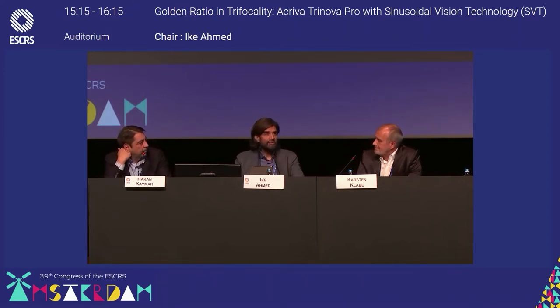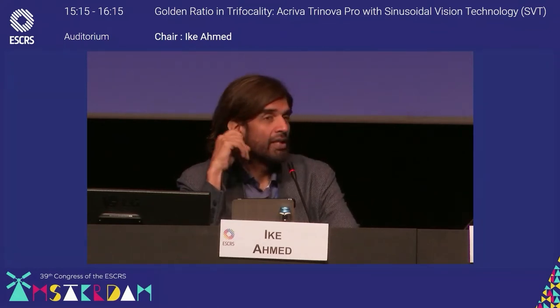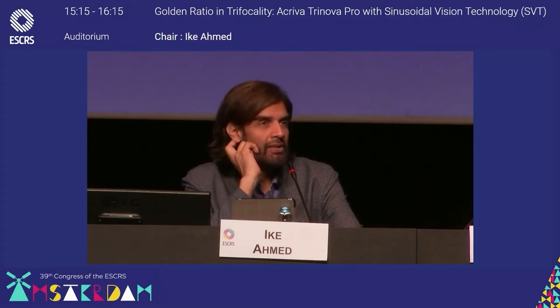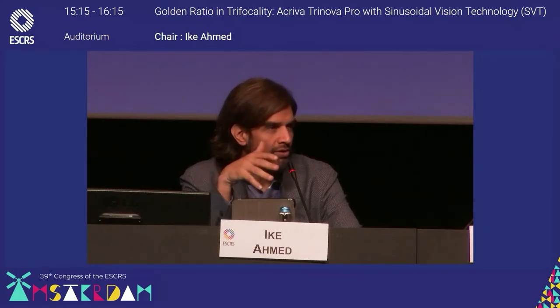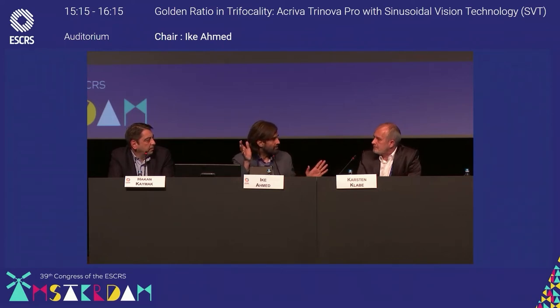Great. Yeah, and I think it's interesting. I'm curious what you think. Many people, I'm sure, in the audience as well have shied away a little bit from multifocal lenses, and you see now the emergence of more EDOF designs in the last 5 years, I would say. We see monofocals coming out as well. So what are your thoughts about really re-looking at multifocal designs? Can these designs bring people back towards multifocals when the concern was because of halos and glare and contrast? Understandably, that's one reason why people go to EDOFs, right? Do you feel these innovations in this type of lens may bring us back a little bit toward multifocals for those patients that we were concerned about?